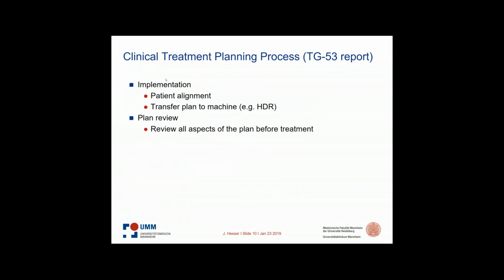The final part, the implementation, depends on what you're doing. For HDR, you transfer the plan to the machine, similar to transferring the plan to the linac for teletherapy. Patient alignment, in these two cases as I mentioned, is not necessary, so we do not have to take that into consideration. And plan review is always recommended.